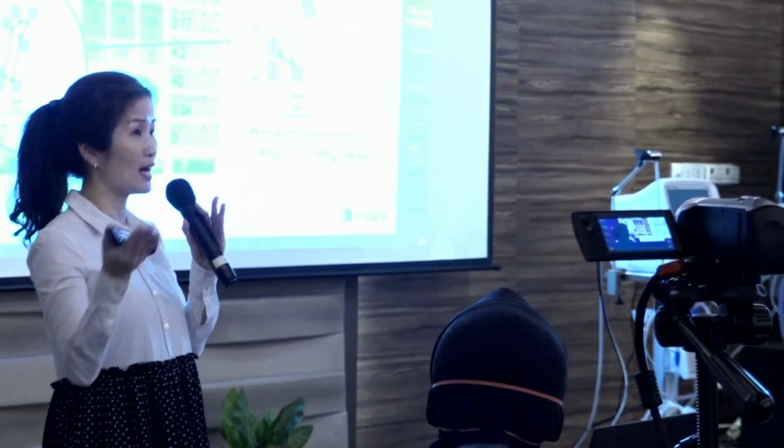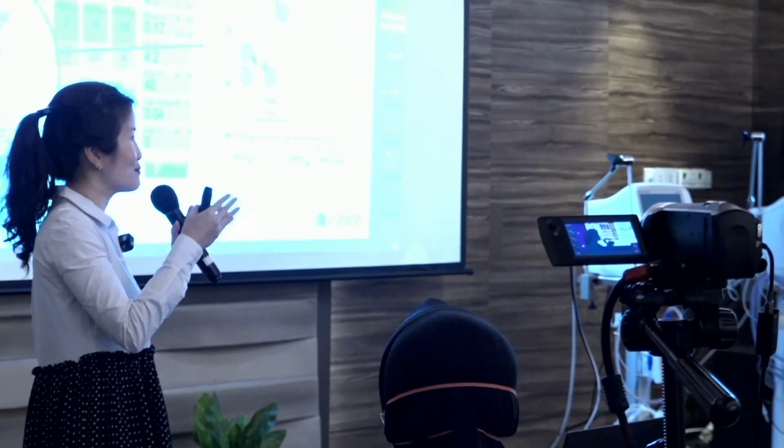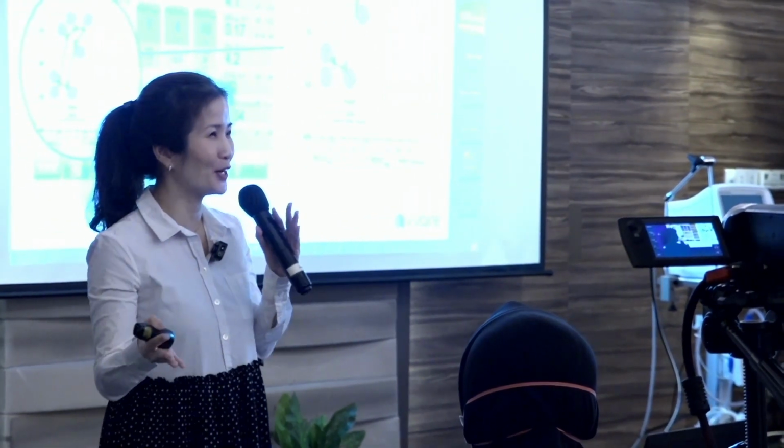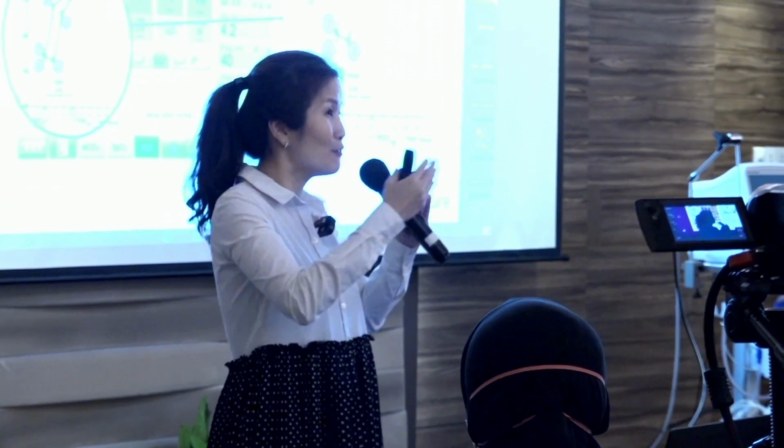It will be best if you can do FOT before and after. But if you give surfactant, you can do FOT after to set the correct PEEP for the patient. Doing it before only lets you see whether it improves after surfactant, but since you know you are already giving it, it's best to save time and do it after you give surfactant. Then you will be able to see how much PEEP and how much mean airway pressure you want to set for the patient. But if you are keen to do a research case study, then you can do one before, give surfactant, and do one after.